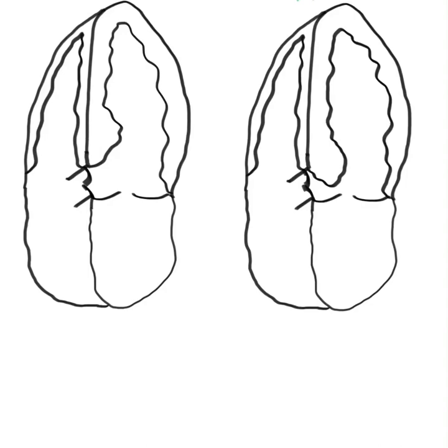All right, so we have two examples of hypertrophic cardiomyopathy here. The difference is that the one on the left is considered HCM and the one on the right is obstructed, so it's considered what we call HOCM. So let's take a look at the actual difference.